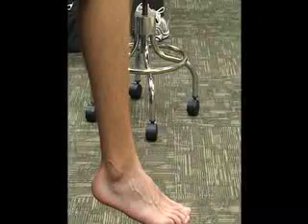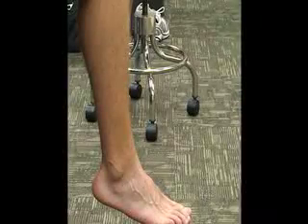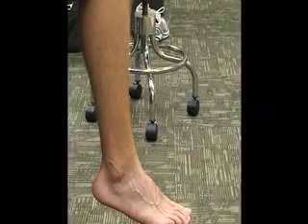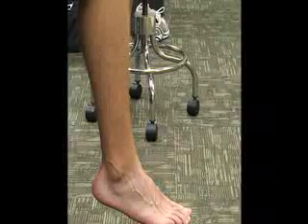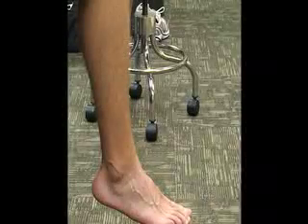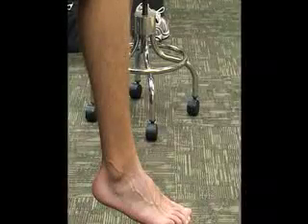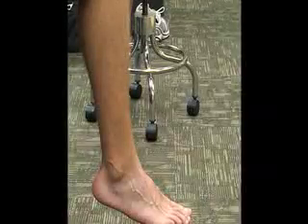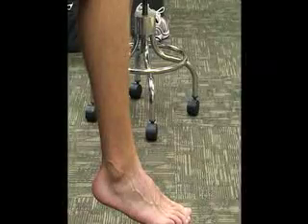Next we're going to do goniometry of the foot and ankle. This is the dorsiflexion of the ankle joint, the talocrural joint specifically. We're going to have the patient sitting on a table with his knee over the edge of the table flexed at 90 degrees and his ankle is going to be in zero degrees of inversion and eversion.